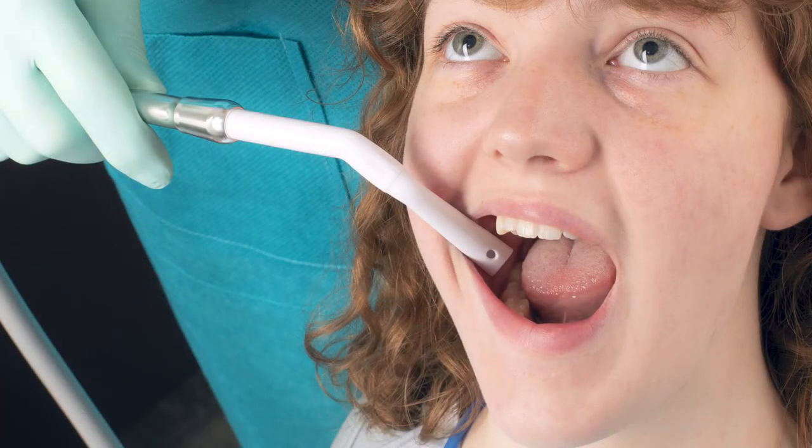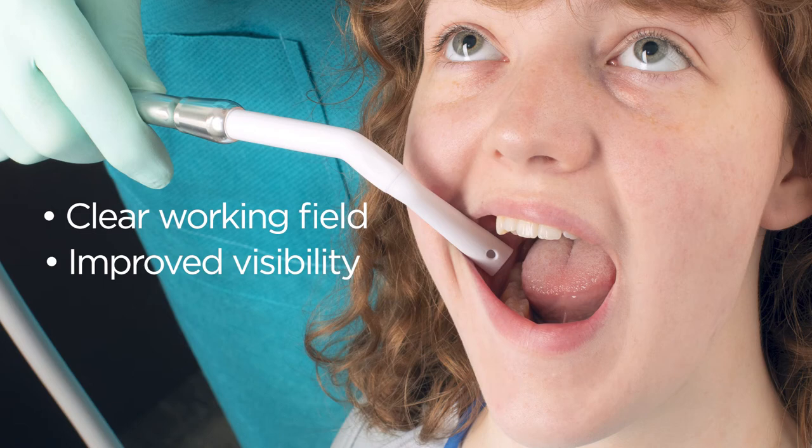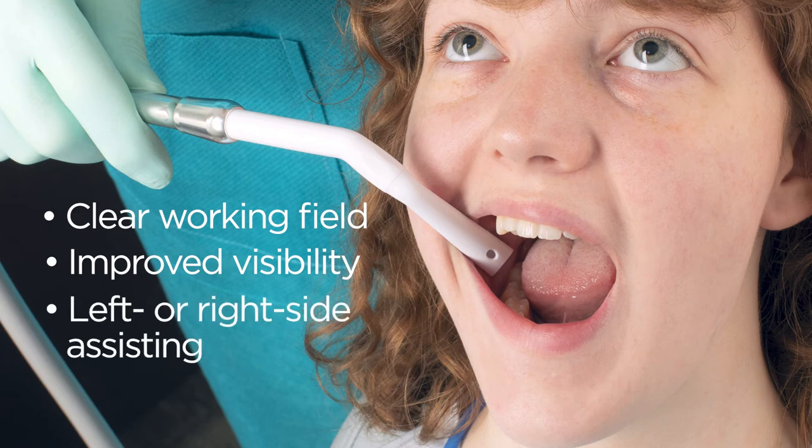The offset approach of Angolese keeps hands clear of the working field, offering improved visibility and access to any quadrant, and Angolese accommodates either left or right side assistance.